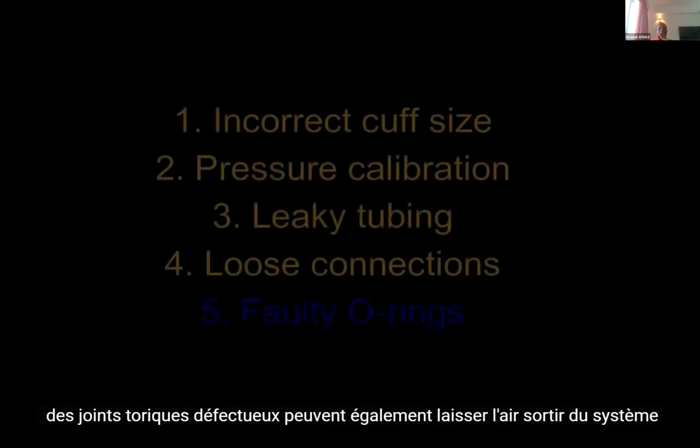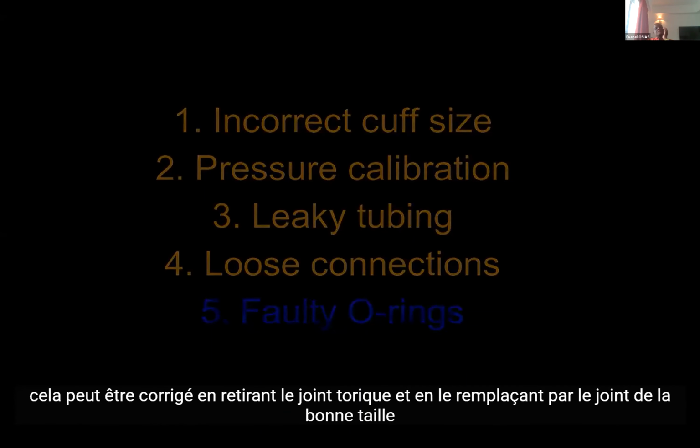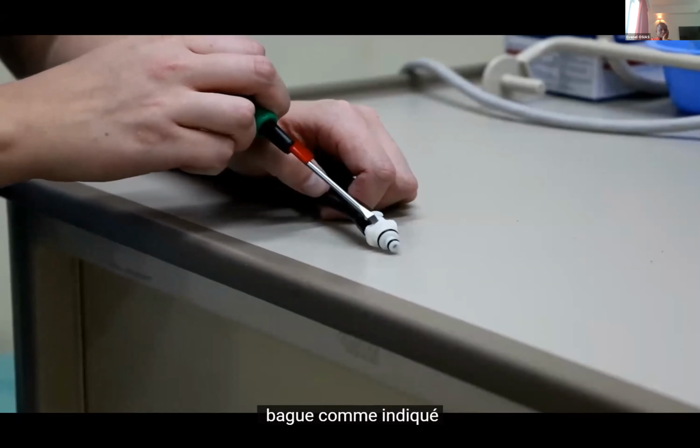Faulty O-rings can also let air out of the system. This can be fixed by removing the O-ring and replacing it with the properly sized ring as shown.